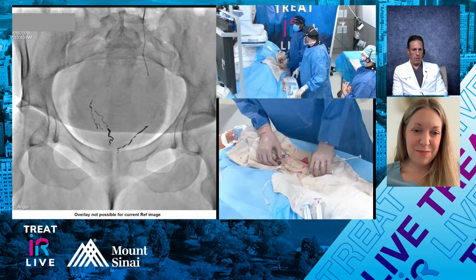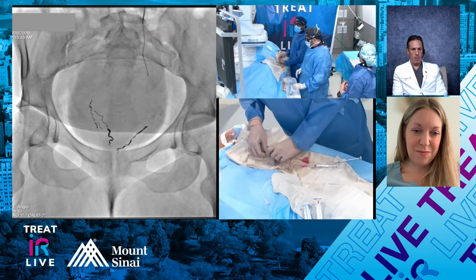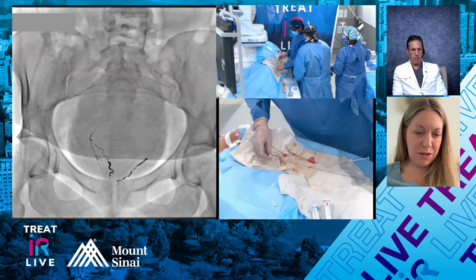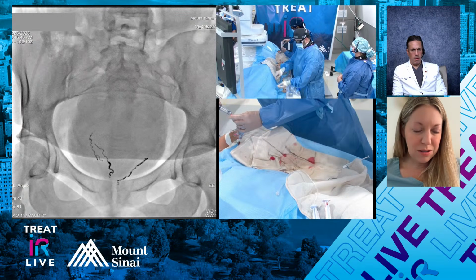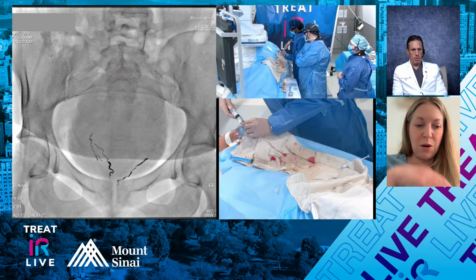We have a 5 French catheter pretty far down. So I'm going to remove my microcatheter here and do a hand injection through that, just to see what it's looking like now. See if anything posteriorly has popped up or anything like that. I like having the 5 French down here for this reason.